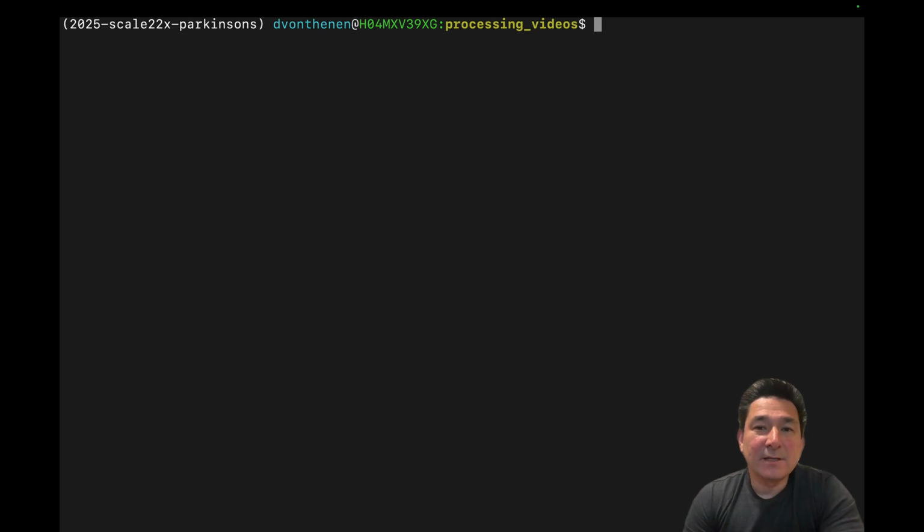So let's take a look at creating a machine learning model for gait analysis. This doesn't have to be used for Parkinson's, but it can actually be used for any type of human movement analysis or machine learning classification. The first step is to take a video and process it using MediaPipe Pose Landmarker. So let's go ahead and do that right now.